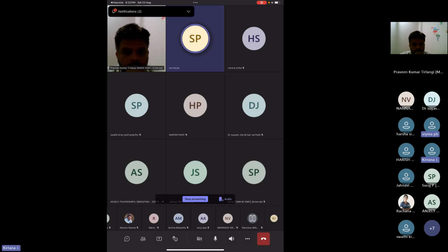Dr. Ayush already said that if it's an obese patient, you can be a little bit liberal with your plateau pressures, because you're thinking that the chest wall is also playing a role. But most of our patients are not that. They're either malnourished or thin built, in which you know that the chest wall is not doing anything. So your plateau pressures are most likely the transpulmonary pressures, because the patient is passive. So I start with the PEEP FiO2 table, and I don't go with high PEEP right away if the patient is hemodynamically unstable.